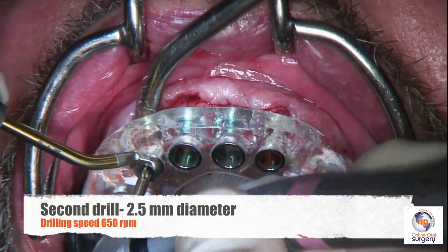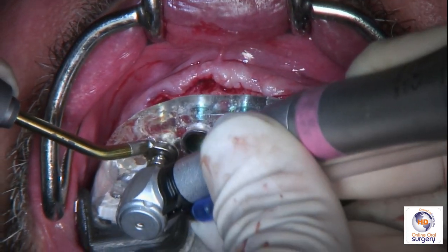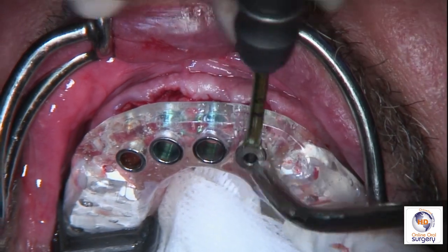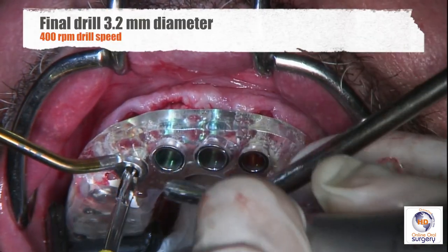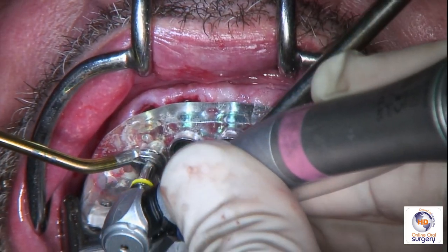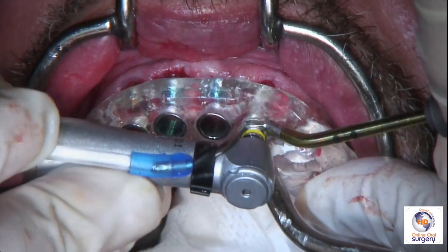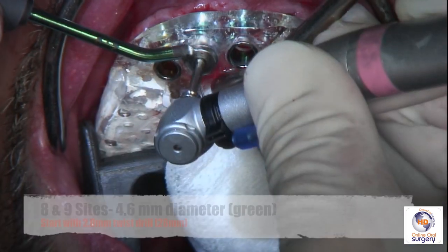Then we're going to go to the second drill, which is a 2.5 millimeter diameter. We're going to bring down the drilling speed from about 800 to about 650 RPM. And again, light pressure, short strokes at both the 7 and 10 positions. And then we're going to do the third and final osteotomy with a 3.2 millimeter drill. And again, we're going to slow down the drill speed as we increase the diameter of the drill. And we're going to go all the way to depth, and this is our final osteotomy for our 3.5 millimeter diameter implants.